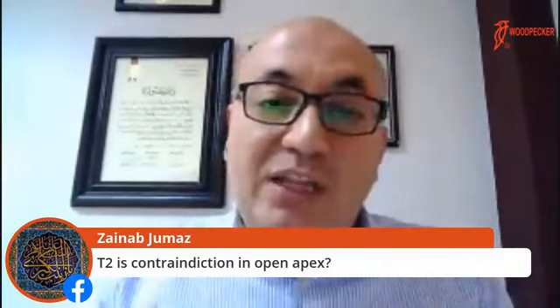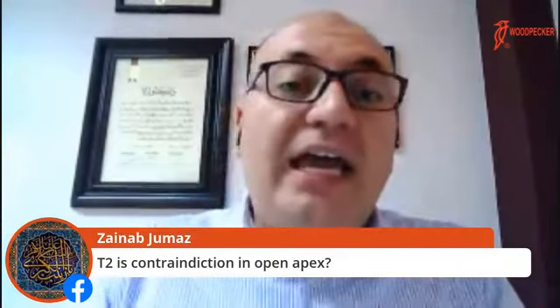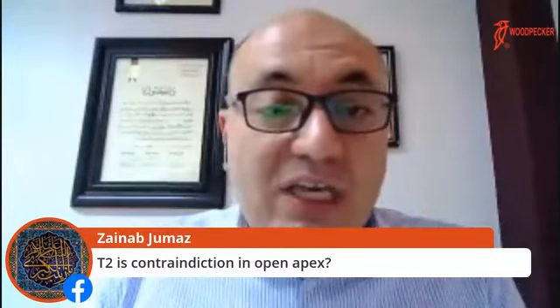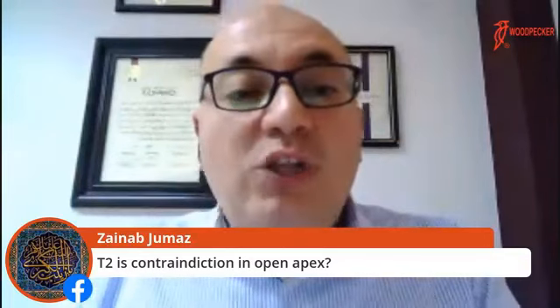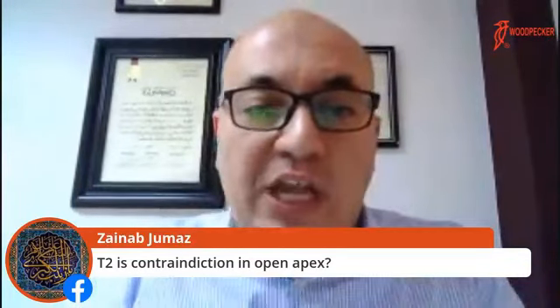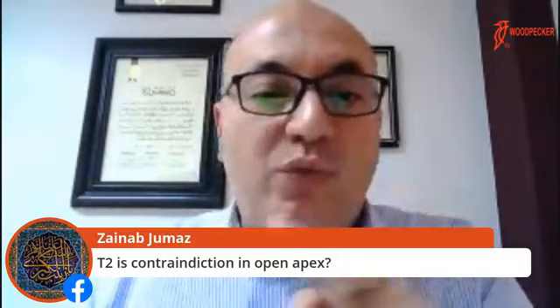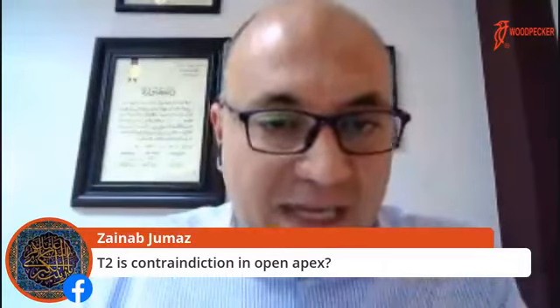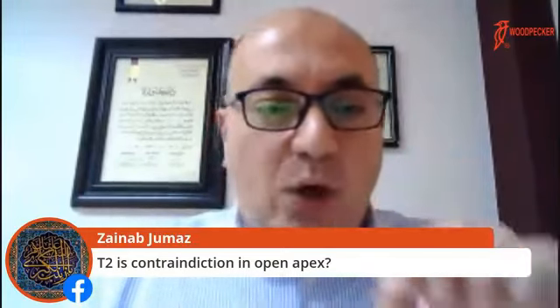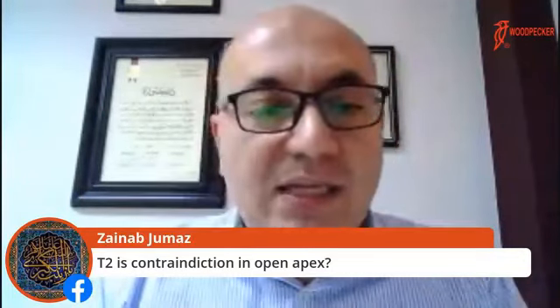Okay? Very important. Whenever you use wider size tips like T3, like T4, like T5, you can increase the power setting. But for the T2, which is the next question from Zainab, if you want to use it for active irrigation, to deliver liquids to clean everything from inside, you have to use minimum power setting from 2 to 4. If you want to use it for activation, you can increase till 6, till 8. But again, minimize the time lapse or the pulses that you are using whenever you increase the power setting. I hope that you get my answer, dear friend.